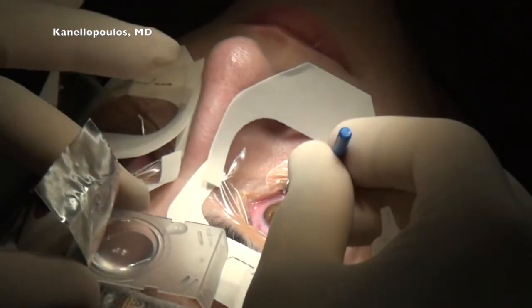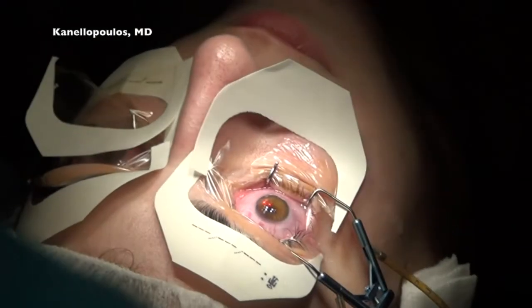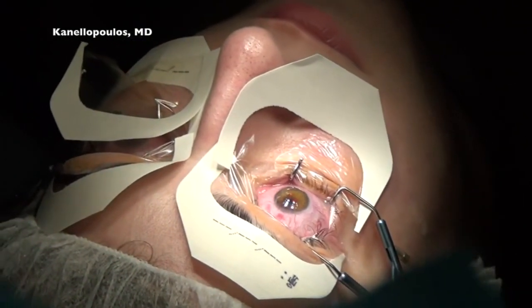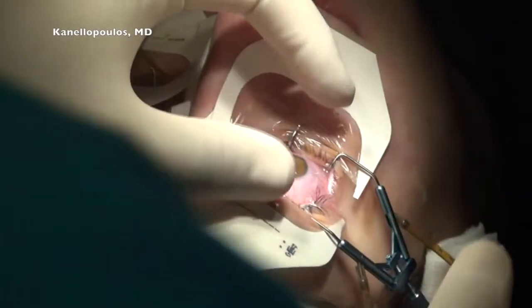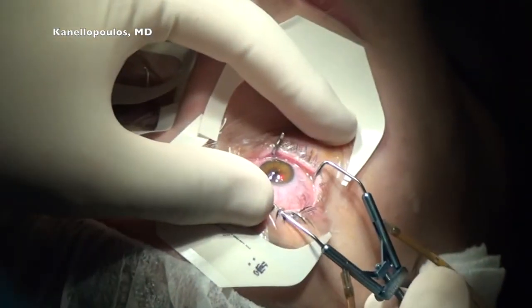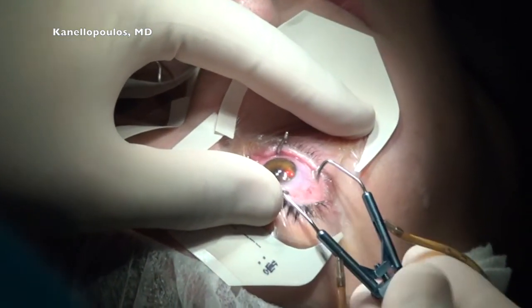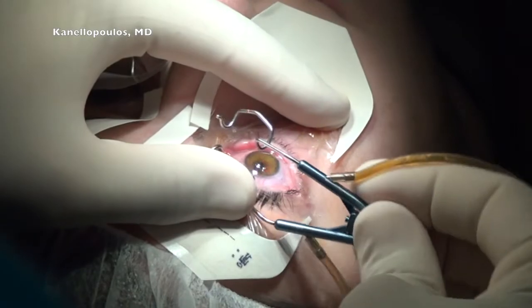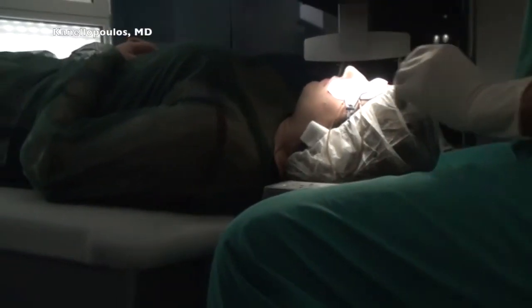We reported extensively how this recovers some of the corneal biomechanics lost in the LASIK procedure, not to be used as a means to perform LASIK in keratoconus or forme fruste keratoconus eyes, but in eyes of younger patients that we're treating for high myopia, we've shown evidence that it may add to long-term stability and also to the way the epithelium remodels afterwards, especially in high myopias.